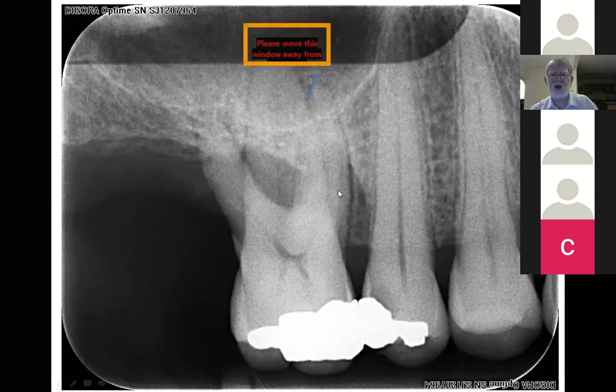But yeah, look, bone grafting, we've referred her to a periodontist, and we'll let the periodontist make that decision on what they can do for her. Again, when you've got a vertical pocket, bone grafting there is possible, but when you've got that horizontal bone loss, it becomes very hard unless you're using membranes.